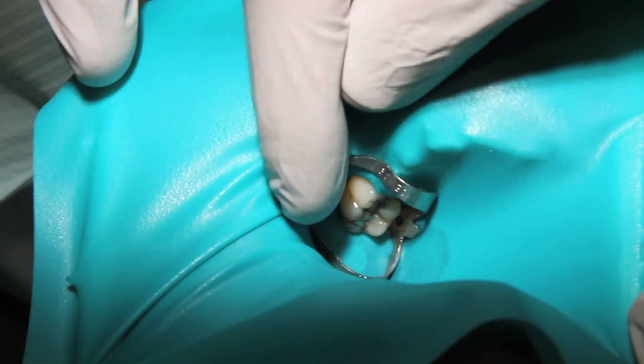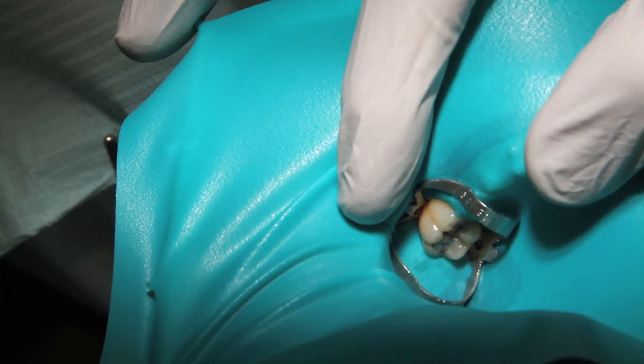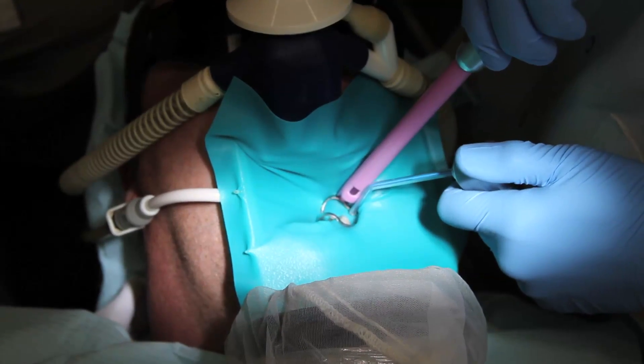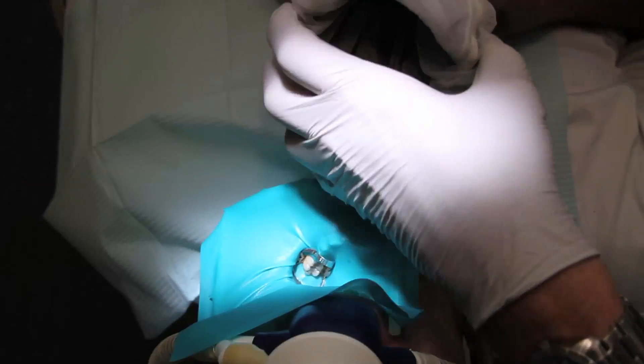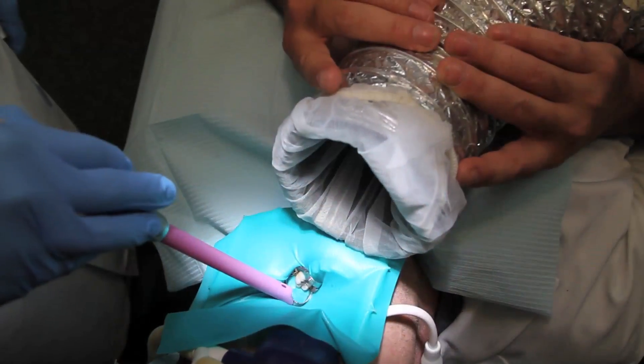These safeguards are now in place to assure that no water or mercury particles can enter your mouth. Now, the important part: we want to protect you from the mercury vapor completely, 100%. This is a custom-designed industrial high-flow vacuum run on a 5-horsepower motor that draws so much air down past your face that the contaminated air can never reach your nose.